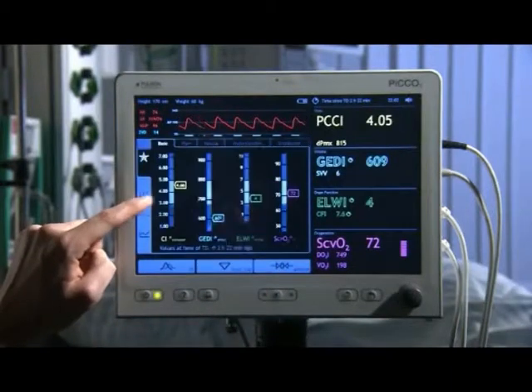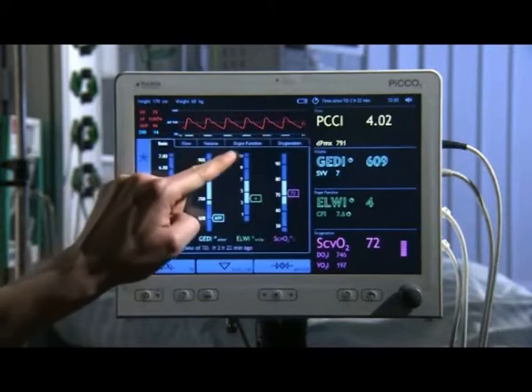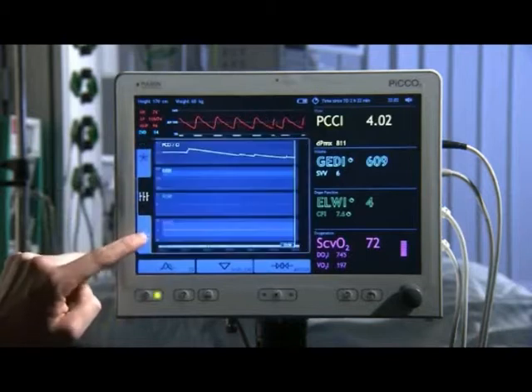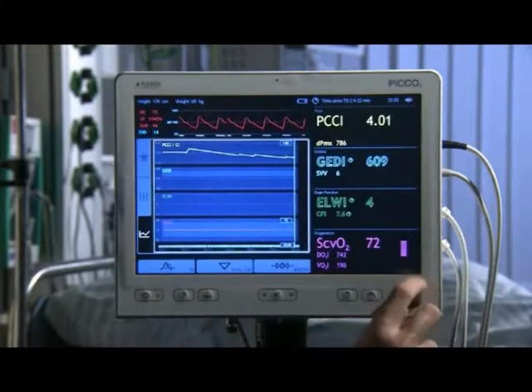The profiles show you the parameters in detail and in functional associations. You can assess the clinical course and the success of therapy from the trends. You can select up to 8 trend curves. With the navigation button, individual parameters at certain points in time can be traced back and displayed.